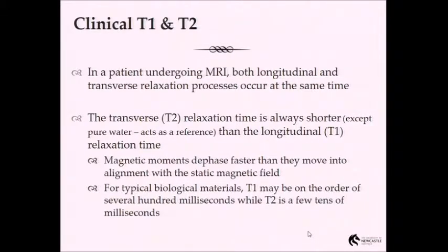So in a patient undergoing clinical MRI, remember I said yesterday that both that T1 recovery and the T2 decay occur simultaneously. So we've got that longitudinal recovery and that transverse relaxation occurring at the same time, the moment that we stop transmitting RF.